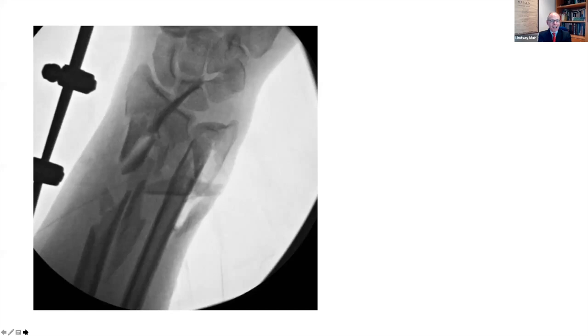Goodness, probably, well, the injury is confined to the radius. I know there's an ulnar fracture, but probably we don't need to worry too much about that. And there's no carpal injury, and I'm assuming there's no injury proximal. So it needs to be a very long plate, and span it and try not to disturb the soft tissues too much. That big fragment there, in between the radius and the ulna, probably still has some soft tissue attached to it. So I might try and stick that back and span it with a locking plate, would be my thought.